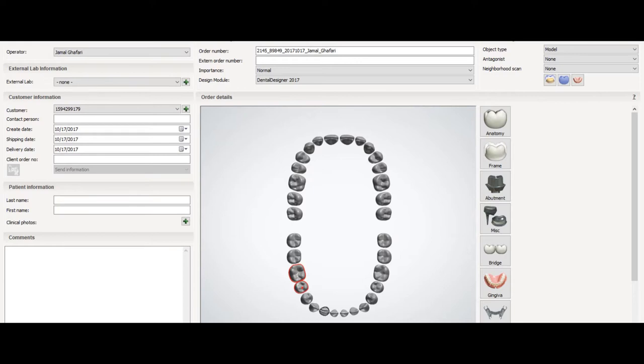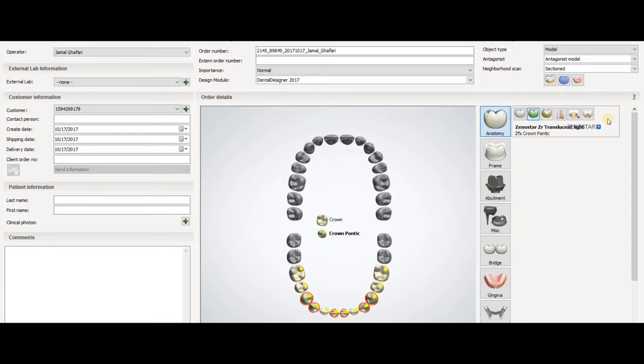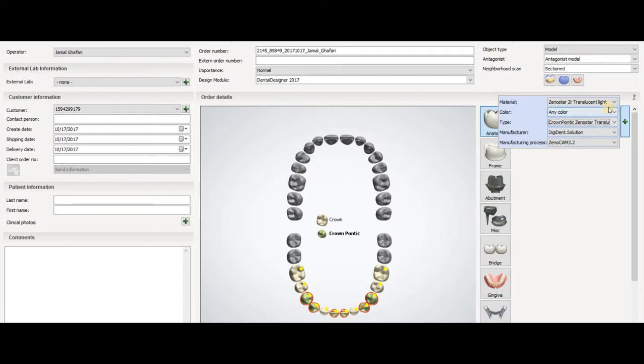We have teeth 35 and 45. The tooth is like that — it has full anatomical crowns, and the rest we will select them as the pontic. You have to select the same material for both.